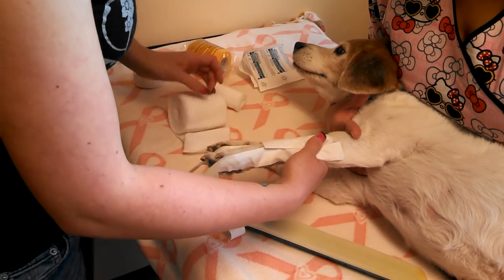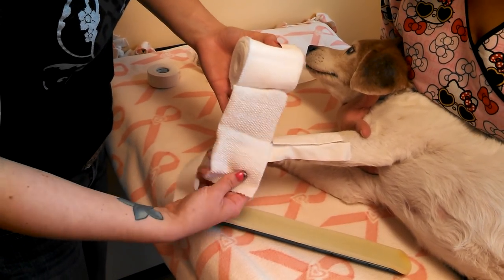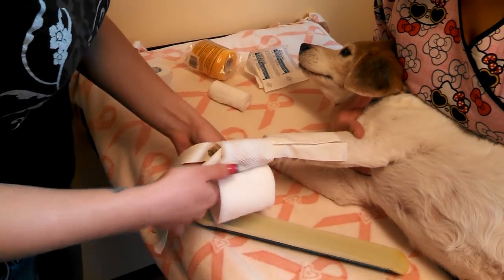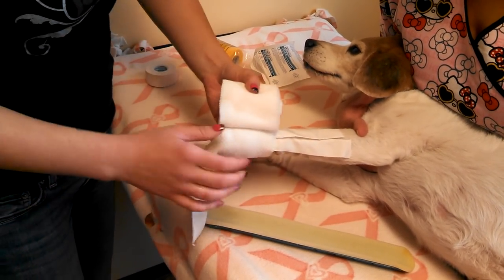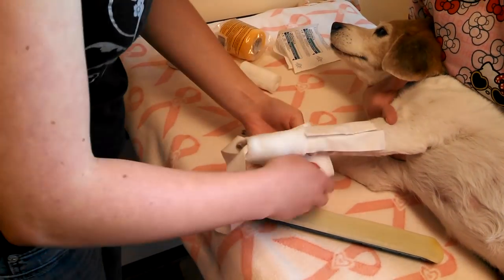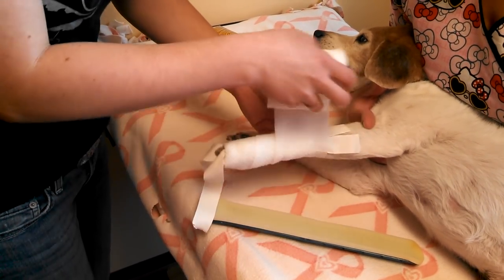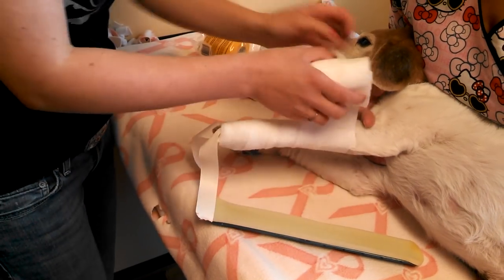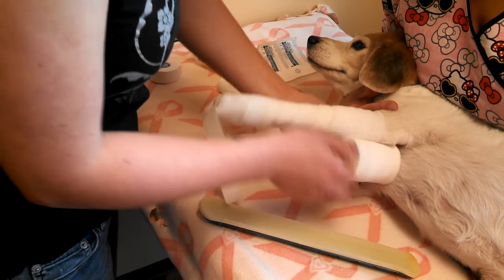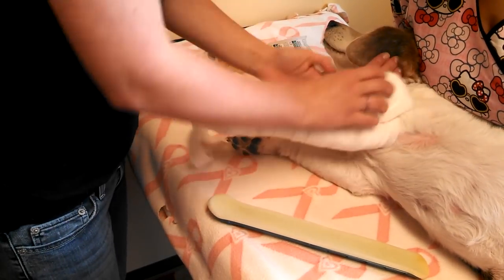Then you're going to apply the cast padding. Always start from the toes and work your way up. You want to wrap the foot and the toes, leaving only the toenails exposed. Cover your bandage material halfway each time you work your way up the leg, and always go above the next joint as much as you can — that keeps the bandage from sliding as much.